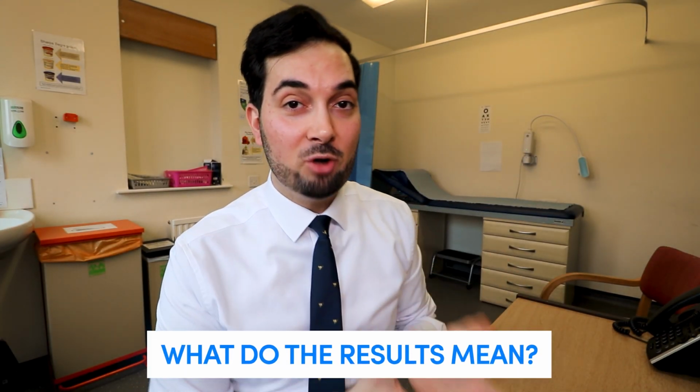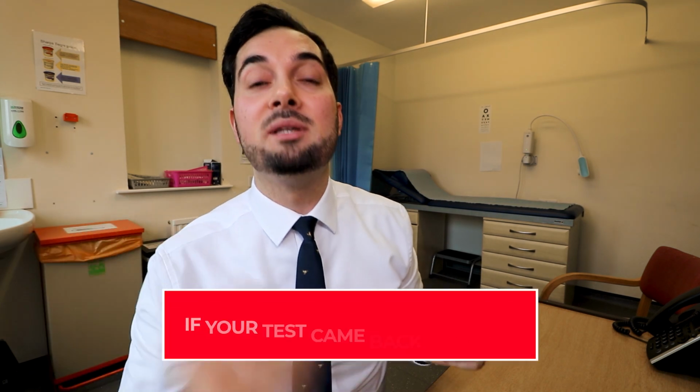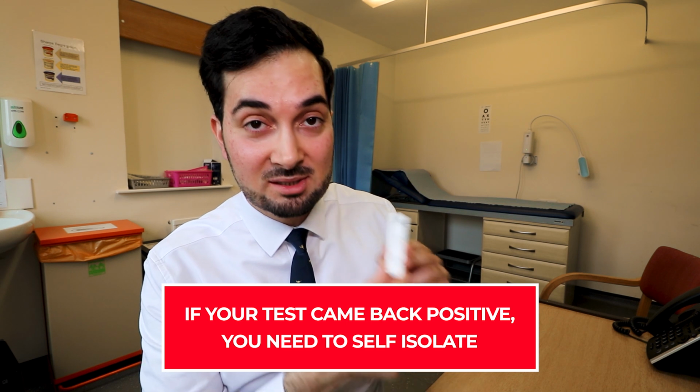So the next question is, well, what do we do with these results? Well, if you've got a positive COVID-19 test result, and it means that you've got COVID-19, and you're not showing any symptoms, you need to self-isolate still, because you've done the test, and it's indicated that you are positive for COVID-19.